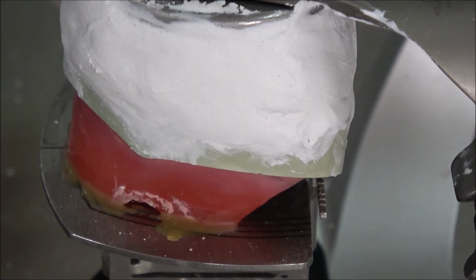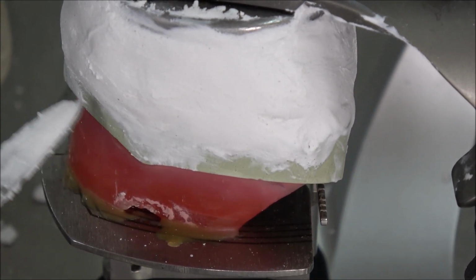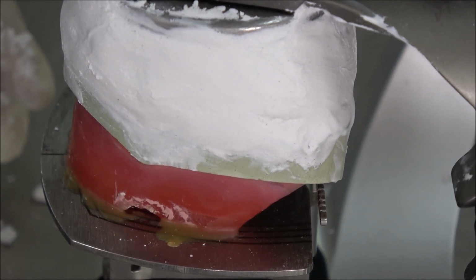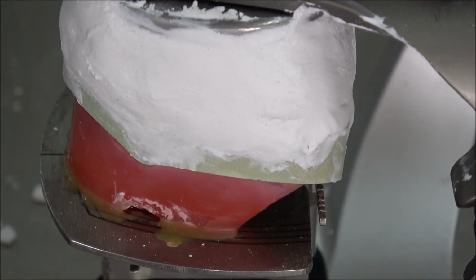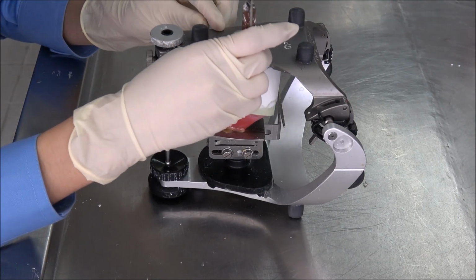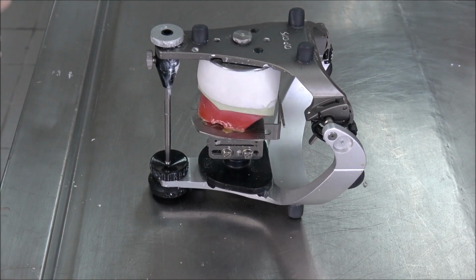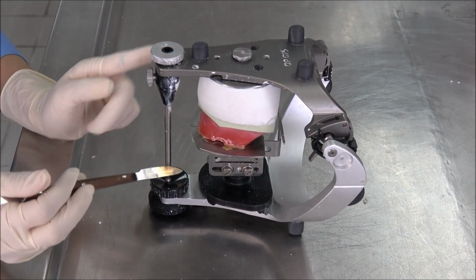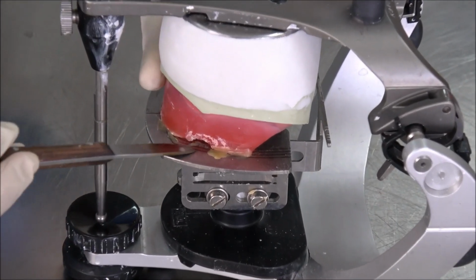Why do we have to extend more onto our model? Because we want to create some more retention to hold our model, to prevent our mounting from falling. Once we are done trimming all the excess, we just leave our mounting here and wait for the POP to set. Okay, once it is set, we will remove our occlusal rim from the occlusal table.